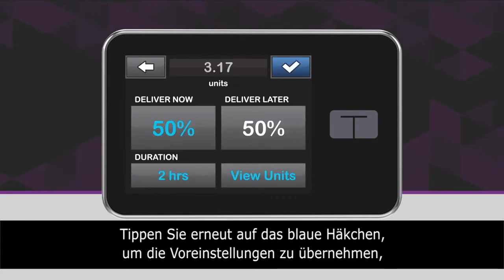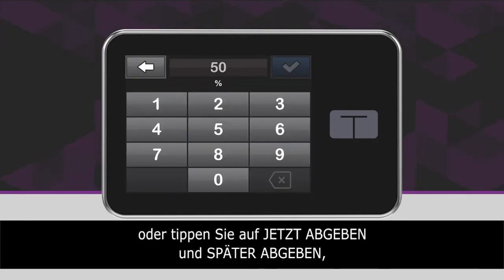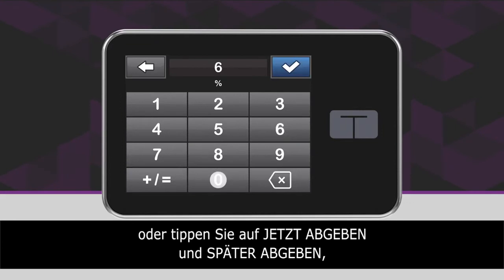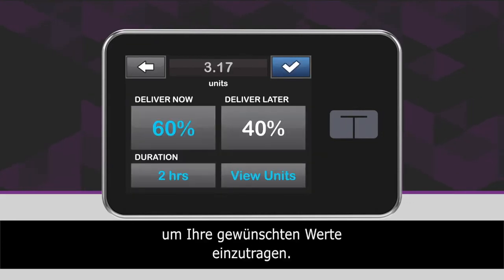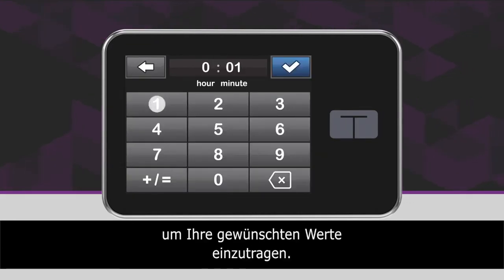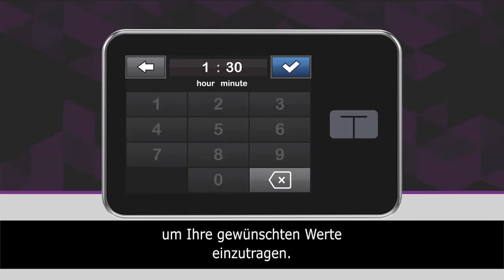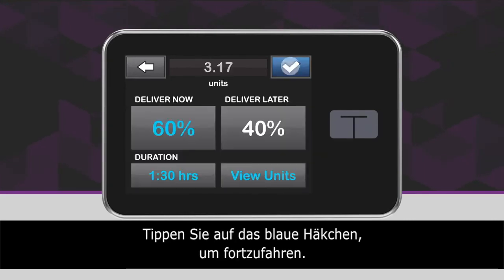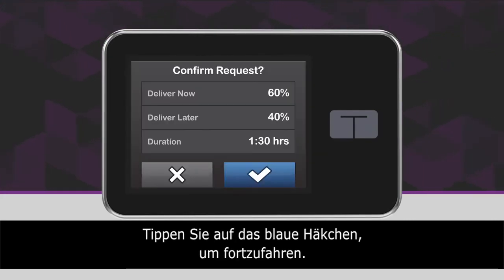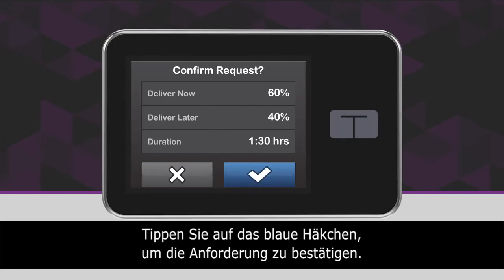Tap the blue checkmark icon to use the default settings, or tap Deliver Now and Duration to set your desired values for each one. Tap the blue checkmark icon to continue. Tap the blue checkmark icon to confirm.